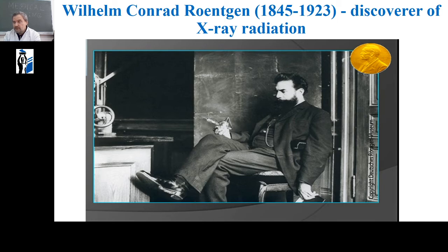And it is not by chance that a piece of harsh cast iron is on the table here. This is a vacuum pump. We remember that vacuum is a necessary condition for obtaining X-rays.